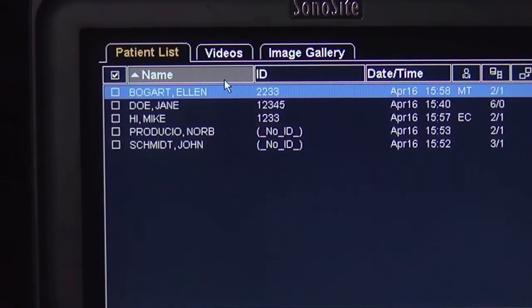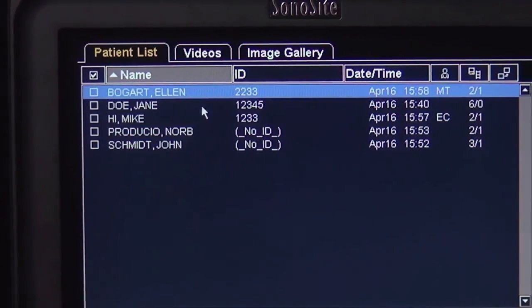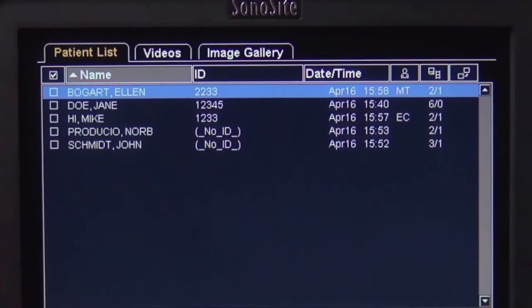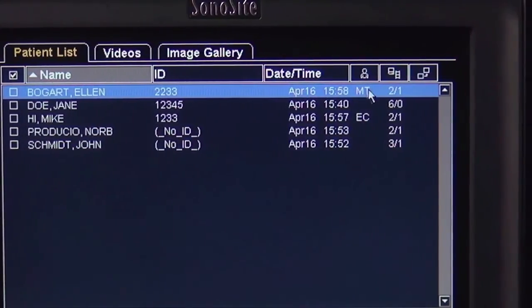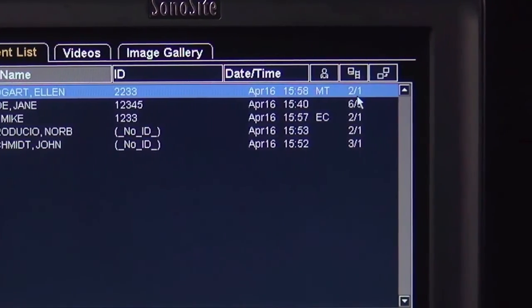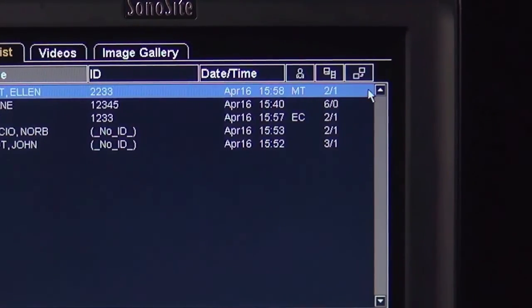The header at the top of the screen identifies patient and image information for the study. This includes patient name, ID number, date and time of the exam, the sonographer's initials, image and clip number, and connectivity.